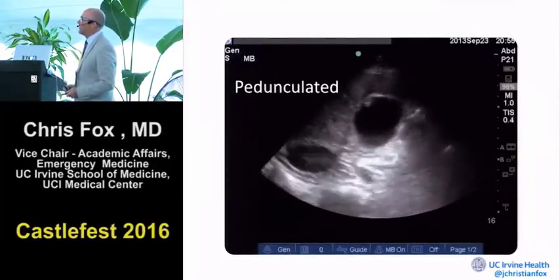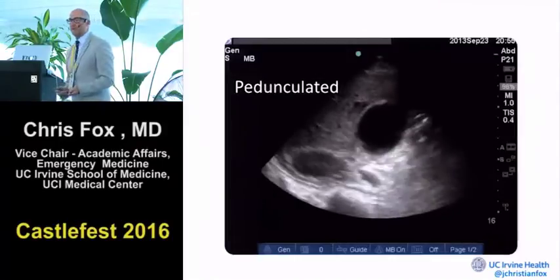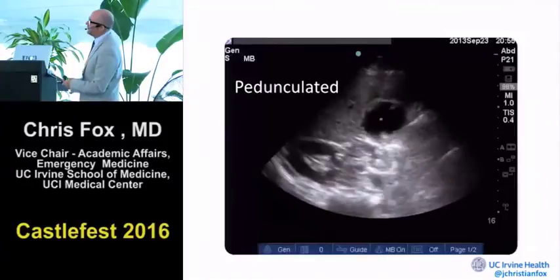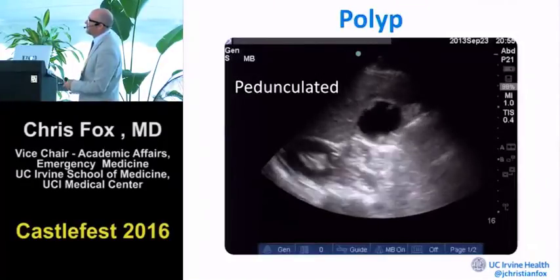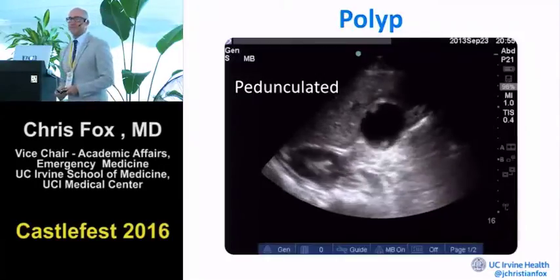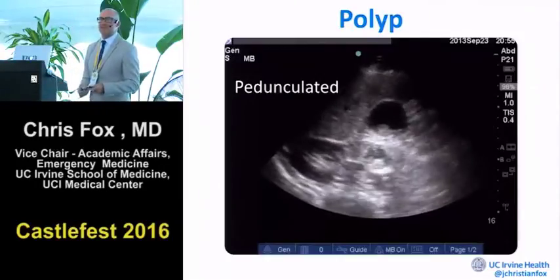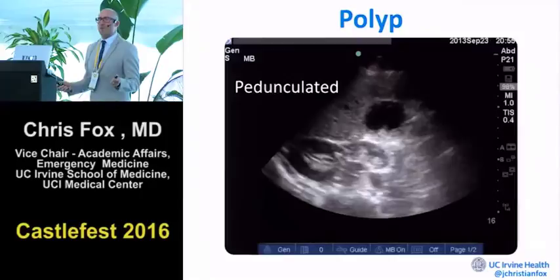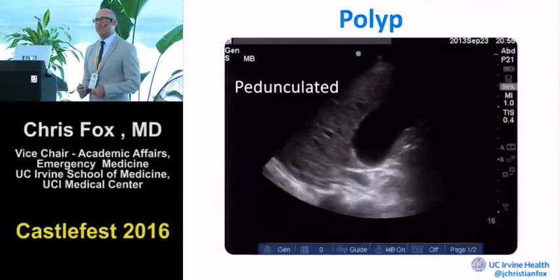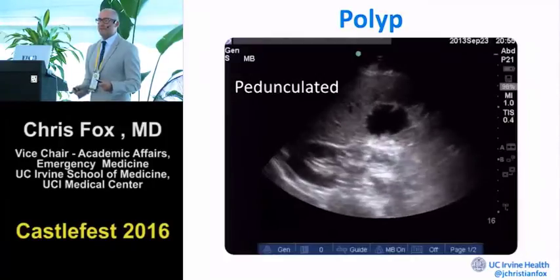And here's another thing we see sometimes. What do we see inside the gallbladder? We see these little pedunculated dingleberries hanging in there. What is that? There are little polyps in there. They're adorable, these little gallbladder polyps hanging around. Love them when I see those things. They're not causing any drama. What if you saw some comet tails coming out of those polyps? What's that when you see comet tails? I have a video of it, but I wouldn't play.